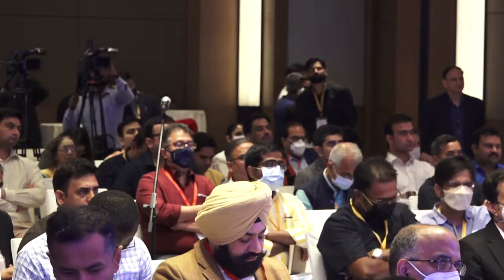So just one last comment, sir. There was a recent paper published from Cleveland Clinic, explant TAVI. The surgeons operated on patients who had failed transcatheter valves. 50% of those patients had indication of infective endocarditis. So that's very important as we are taking up TAVI in our routine practice. You see the patients who underwent surgery, 50% of those patients had infective endocarditis. So I think we should be doing TAVI as if we are doing a surgical AVR and not a stent.